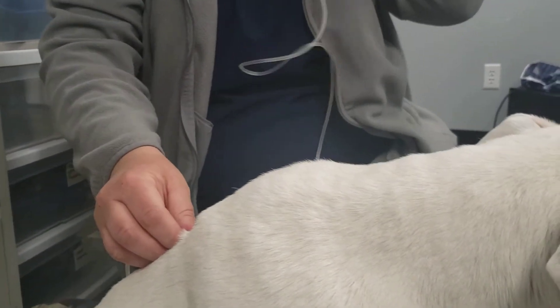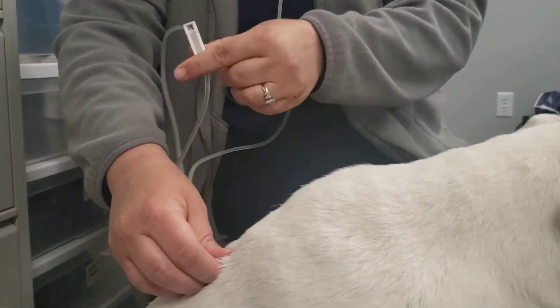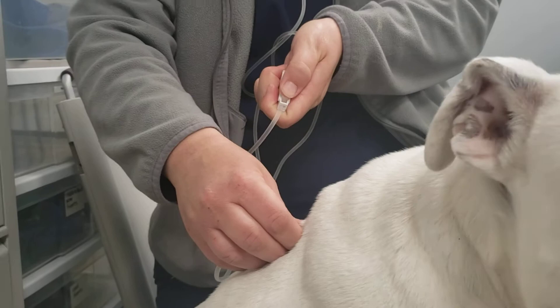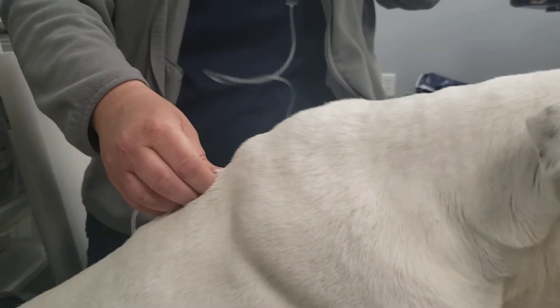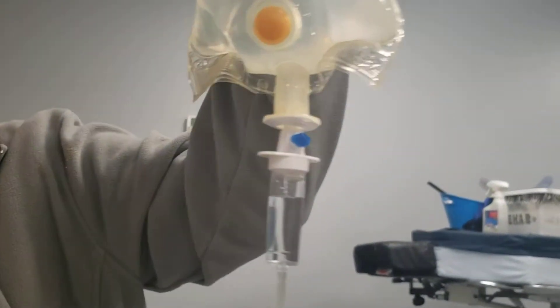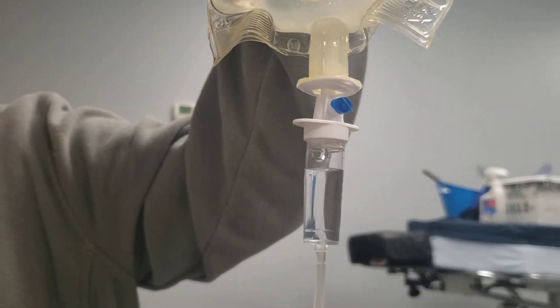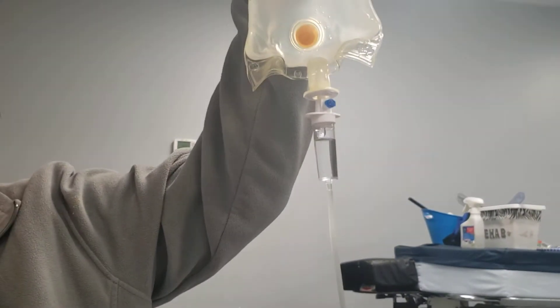What's going to release the fluid is me turning this dial. I'm going to pull that back up and that's going to take the pressure off. And then you're going to see that flowing — that nice steady flow. A drip is fine too. The higher you hold it, usually the better the flow you get.